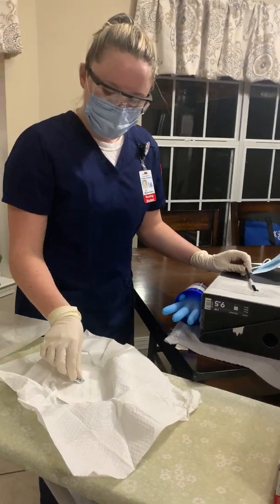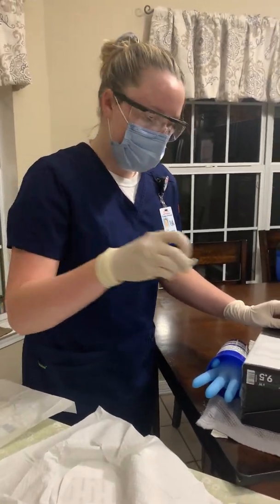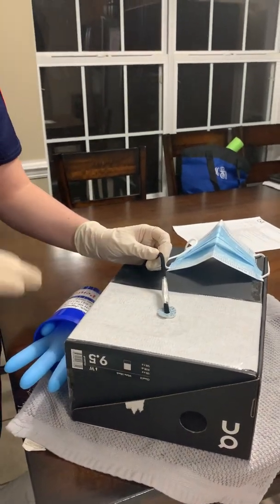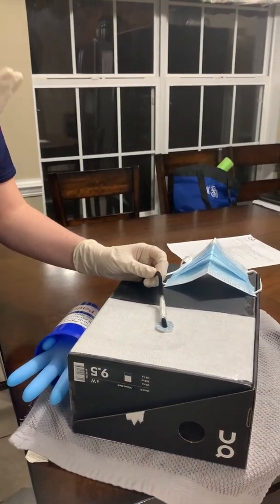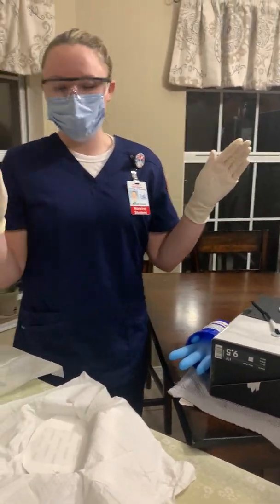And then the next thing I'm going to do is pick up my bio patch. Since this hand is sterile, I'm going to pick it up and place it right there. I'm going to place it blue side and words up. And after I've done that, I can set this back down. This hand is non-sterile, this hand is sterile.